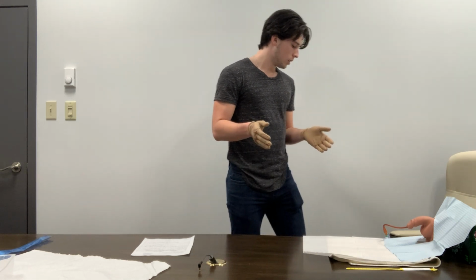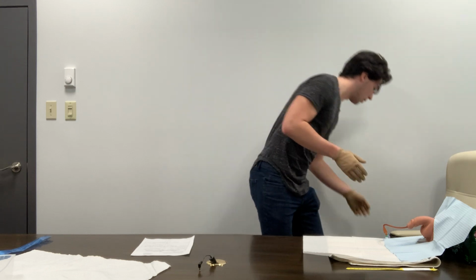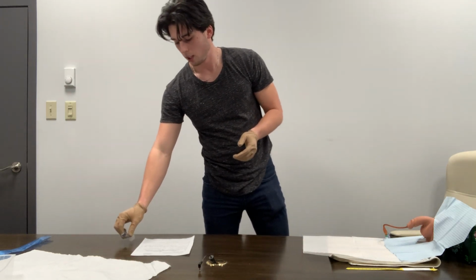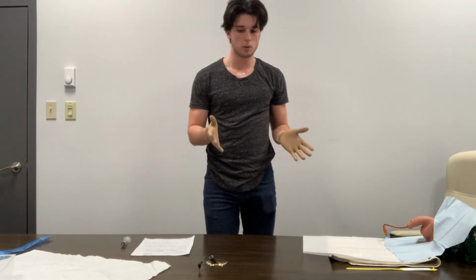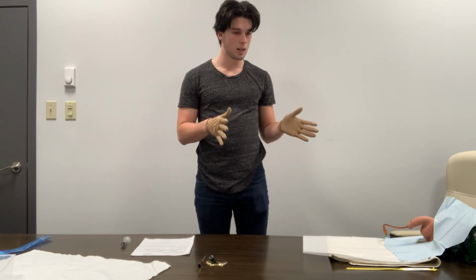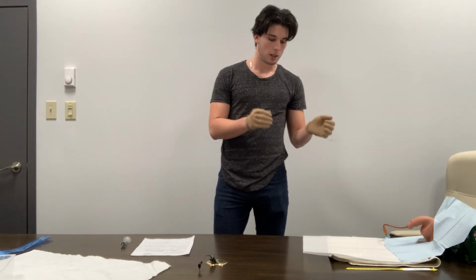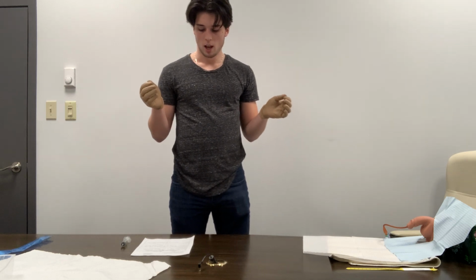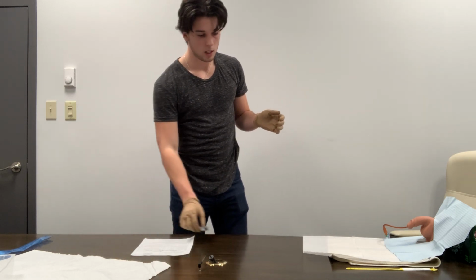So in this case, we would go grab our syringe here. We'd grab a new syringe, as well as an absorbent pad to go under the patient. We would wash our hands. We would make sure pericare is performed, and we're going to say that pericare was already performed. After we wash our hands, we will enter the patient's room with our supplies.